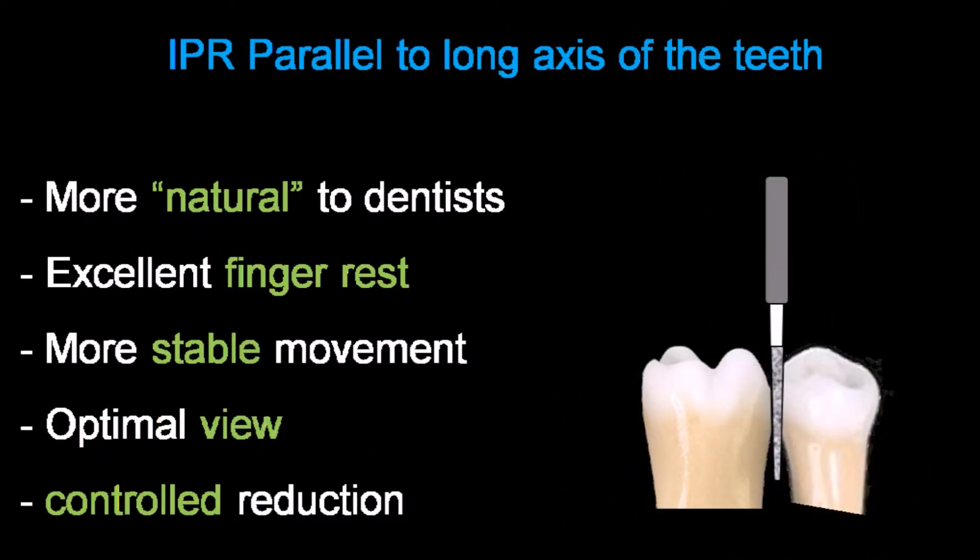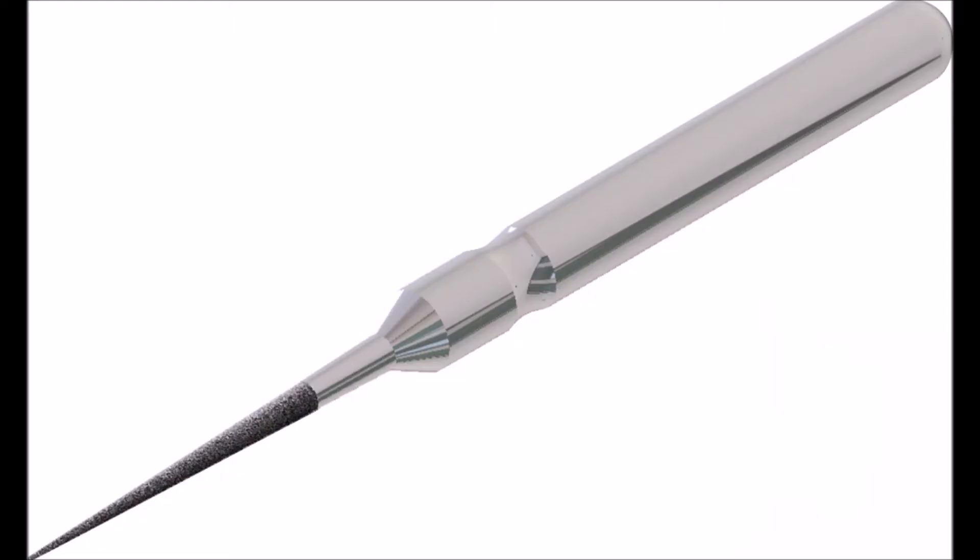The E11S is a new and innovative diamond burr for IPR. Performing IPR with the burr parallel to the long axis of the teeth is most recommended. The separation movement is more natural to the doctor. There is excellent finger rest which provides optimal hand stability, excellent working field visualization, and the reduction is uniform and well controlled. Its small diameter of 0.2 to 0.3 mm and its length allow stripping IPR parallel to the long axis of the teeth.